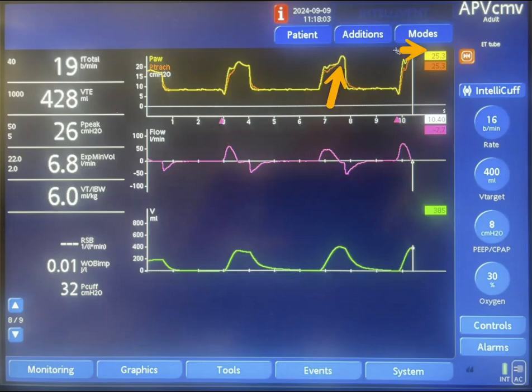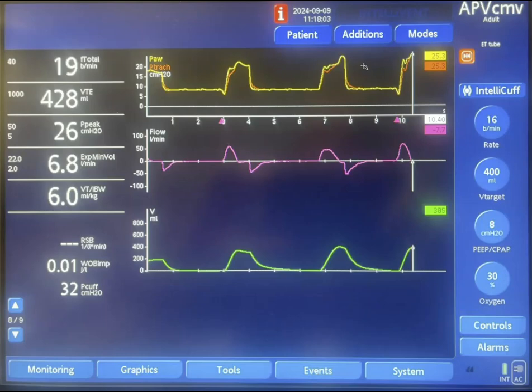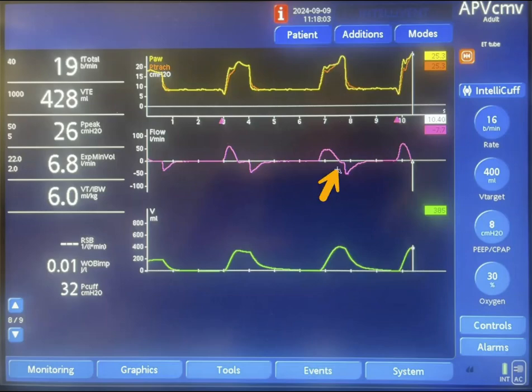However, the machine did not finish inspiration till this point. This means that the inspiratory time on the machine is longer than the patient's inspiratory time — so this is delayed cycling. The cycling on the machine is longer than the inspiratory time of the patient; the patient exhaled while the machine was still in inspiration.